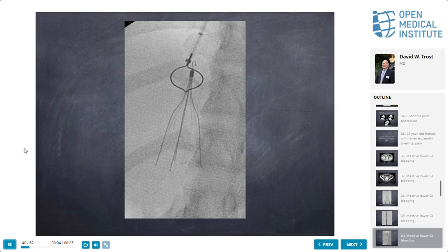Today, we would not do as much lysis. We would do mostly mechanical thrombectomy using the various systems that are out now. Same one that I showed you earlier for the lung. We would use that and at least debulk the clot, maybe give a little bit of lytic, but in general, we can usually clean this up pretty quickly.